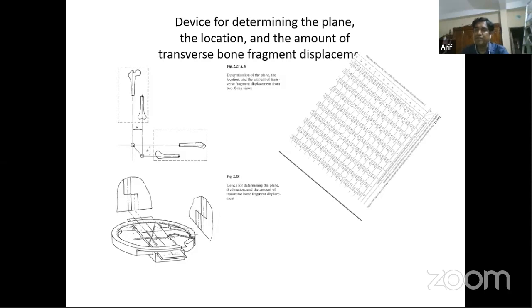And in Paley's books, you get the idea of oblique plane deformity. I did my thesis on the Ilizarov method for hypertrophic non-union with deformity. In Paley's books, he usually puts all the things in a graphical manner: how much magnitude of anterior deformity, how much magnitude of lateral deformity, then draws a line with the resultant, and after that he calculates all the things.